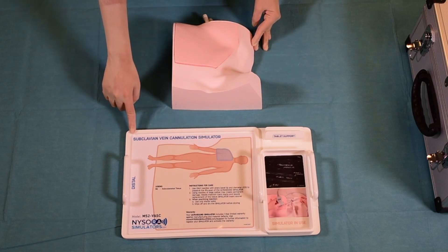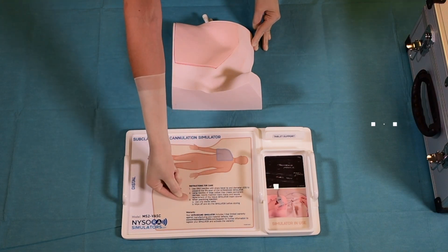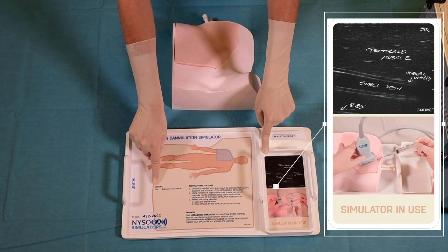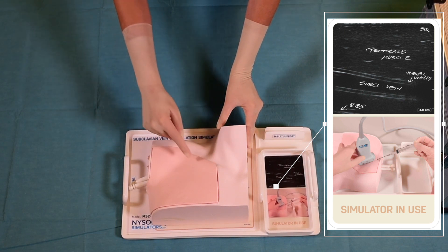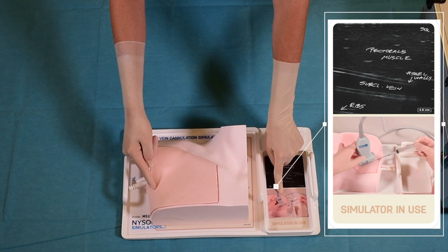Clear instructions for use are also provided, and all anatomical landmarks and abbreviations featured are printed on the label that accompanies the tray. The tray also contains an image that demonstrates proper probe position and needle handling in order to access the subclavian vein.